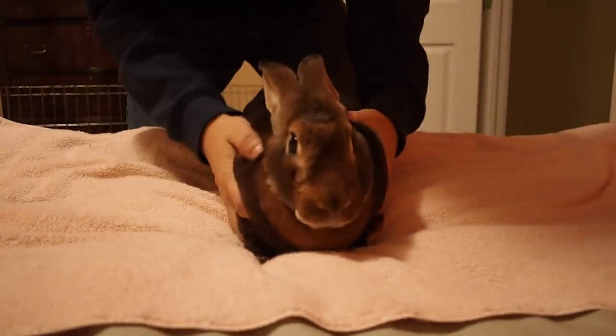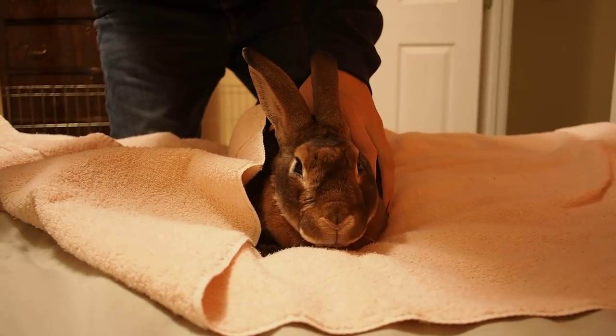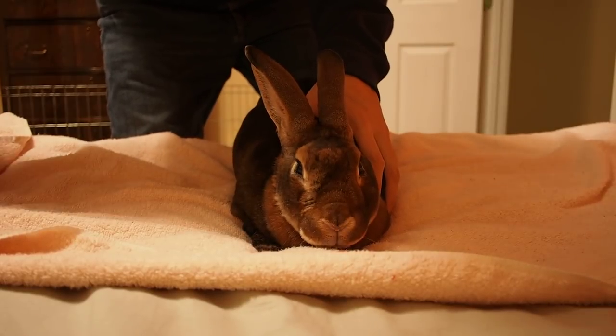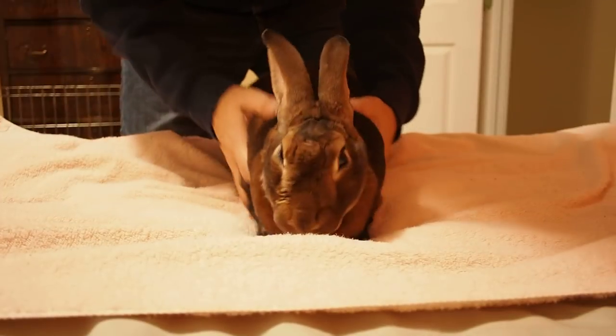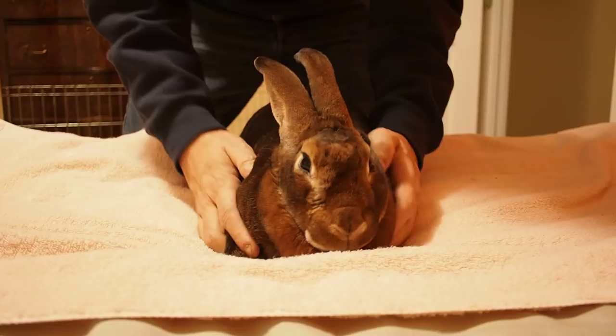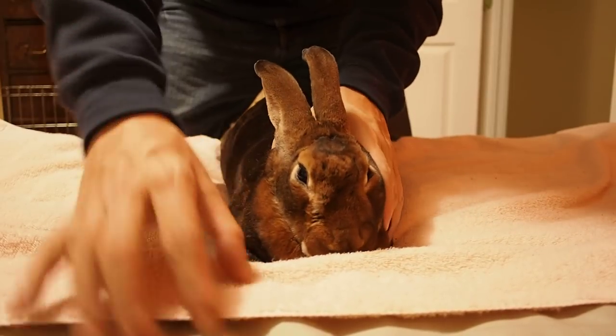So you find a rabbit and you put the rabbit right here. Now, I do a little bit different bunrito than a lot of people do. I don't suggest you do this type of bunrito every time, but I think it's the most effective for this type of restraint — although it's a little brutal, and I'd only do it under very close supervision.